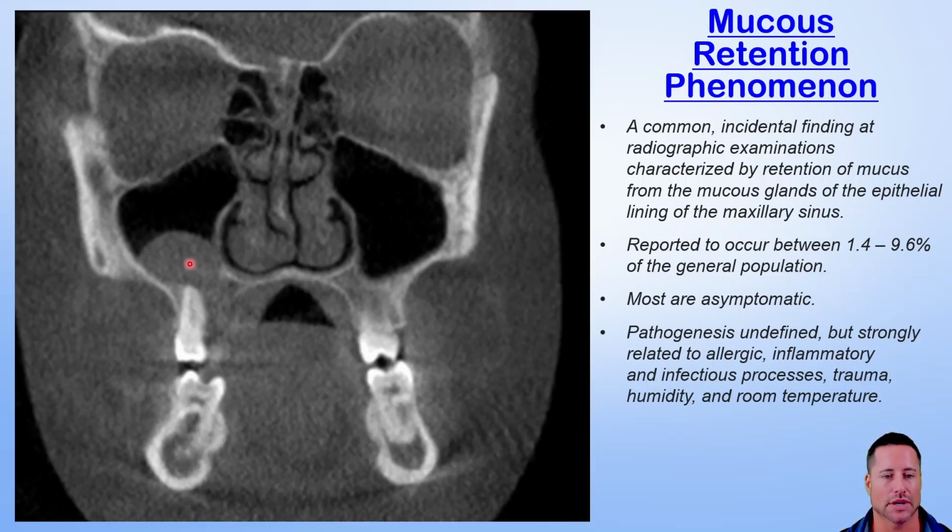Okay, so again, you can just look at that. Parents will sometimes be like, what's that thing? And I proactively explain to them, oh, that's just a variation of normal. It's like a little cyst within our sinuses that we get. And oftentimes that tips me off: maybe this child is suffering from allergies.